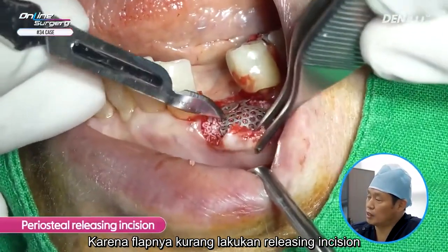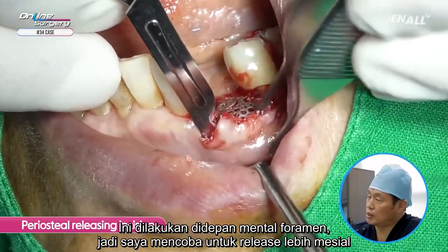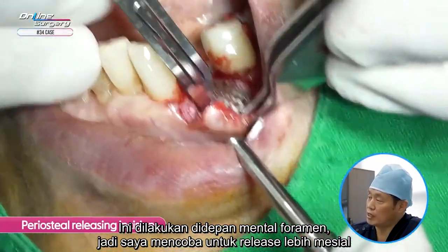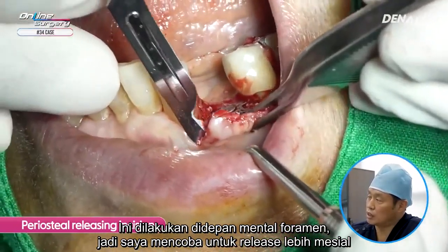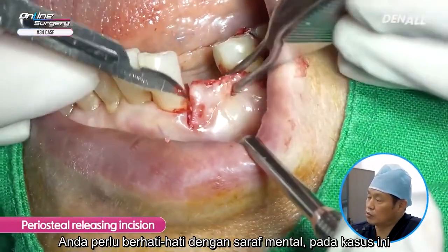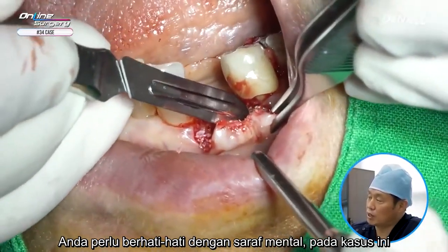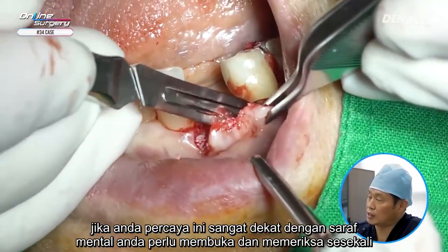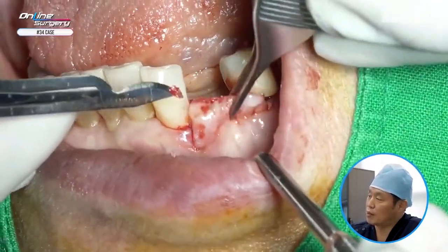Because the flap is lacking, a releasing incision is done. This is in front of the mental foramen, so I try to release more mesially. You need to be careful of the mental nerve in this case. If you believe this is very close to the mental nerve, at times you need to expose and check.